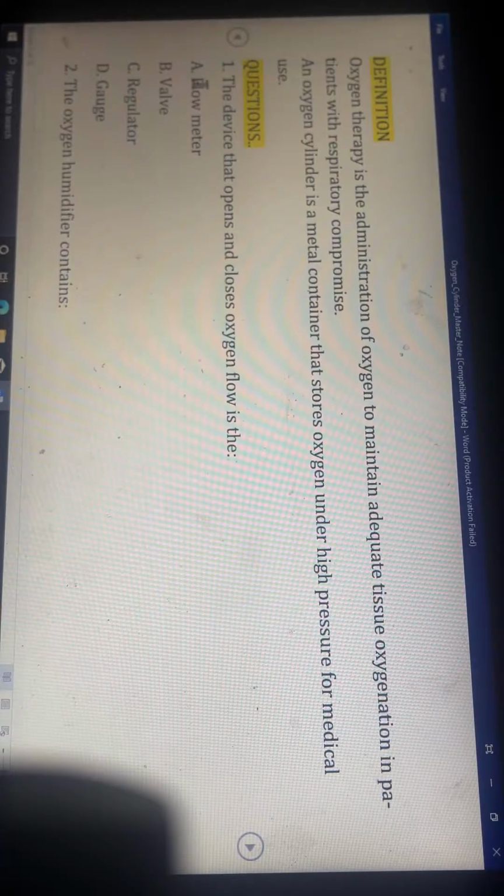I want you, for being in this academy, when you work in the hospital, you are different. People will wonder, where are you coming from? You will tell them you're a student of Nurse Brainy by God's grace. Are we together? So you are able to identify everything. Once you see a nurse putting water into the humidifying cup, you tell them no. As a quality improvement nurse, it is not right to put ordinary water or tap water. What we use is sterile water or distilled water. They will wonder and they will know truly you are a quality student.